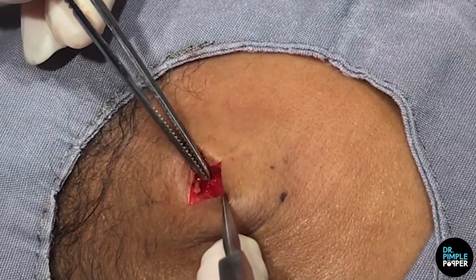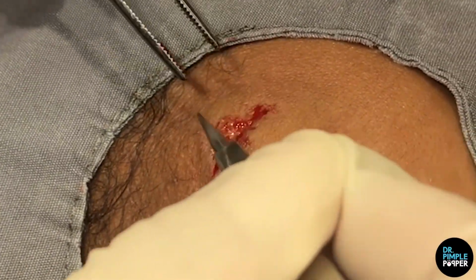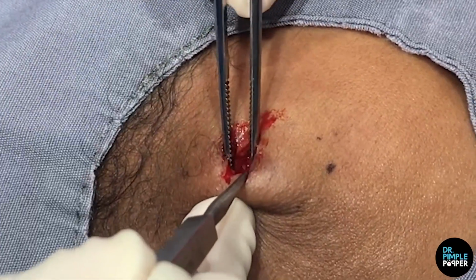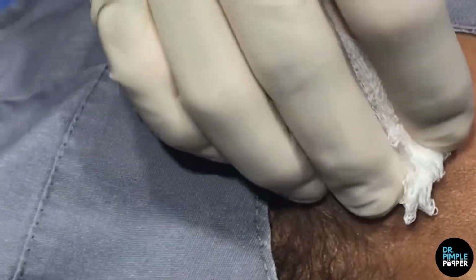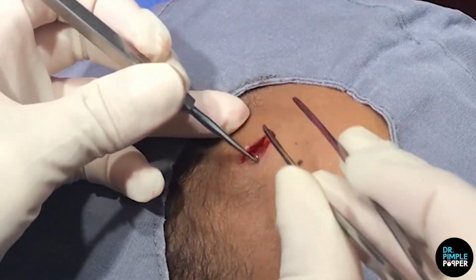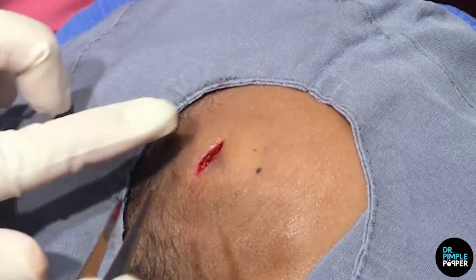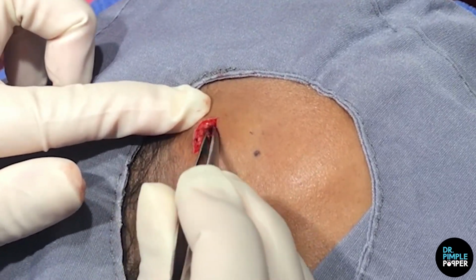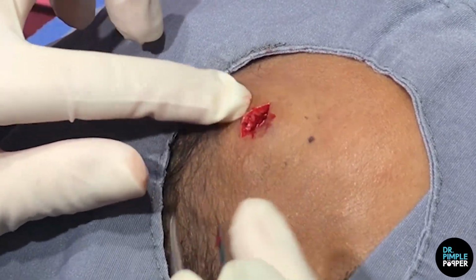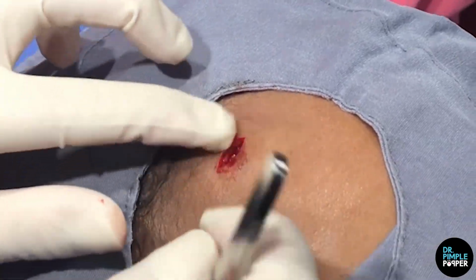So I use my finger to push up on this end and see if anything bulges out there, but I don't see anything. Over here, nothing. Nope. Over here, I think we're pretty much almost done. You don't see anything under there, do you? I don't think so. Go on this side. Looks pretty good to me. Okay, I'll just feel around. Push this on something here. It's hard for me to tell, you know what I mean, girls, right here, but I don't see anything. But I just want to make sure that's numbing.